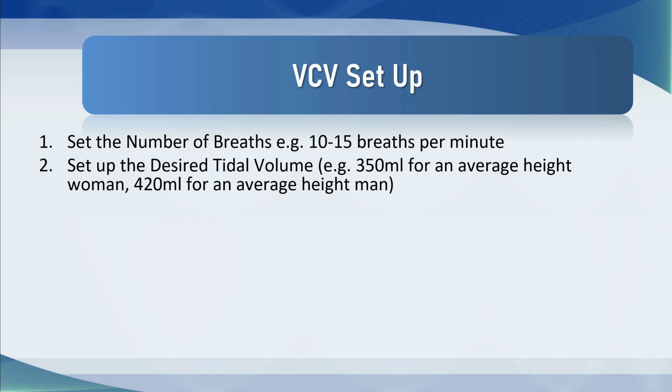And be aware, of course, that the tidal volume, even though if you read the journals, it will say mils per kilo, is really mils per kilo of predicted body weight based on height. It's all about height. The taller you are, the bigger your lungs are. Obviously, if you put on weight and become obese, your lungs don't get any bigger. So it's all about the height. So that's a kind of a ballpark figure.